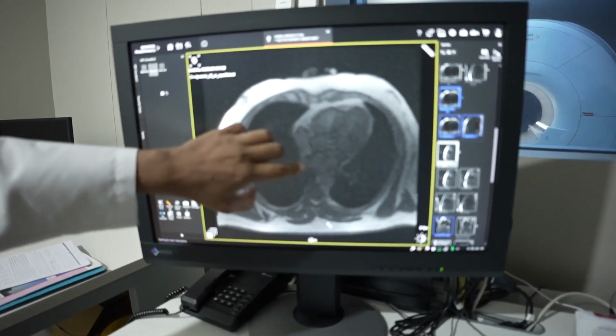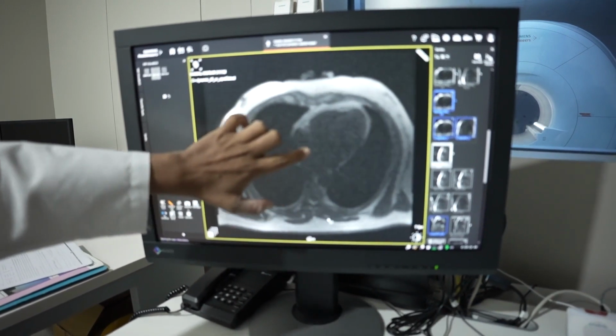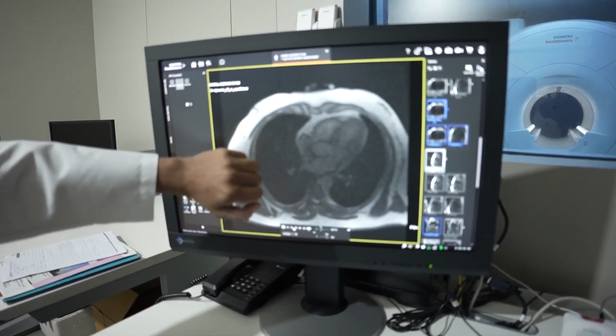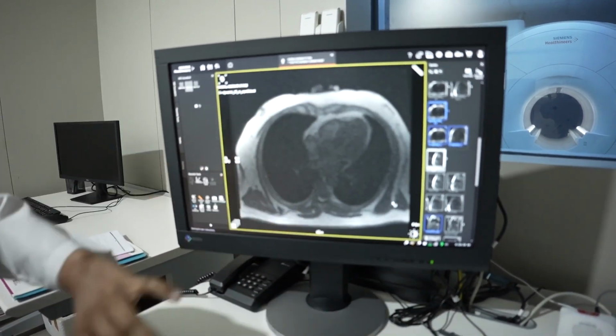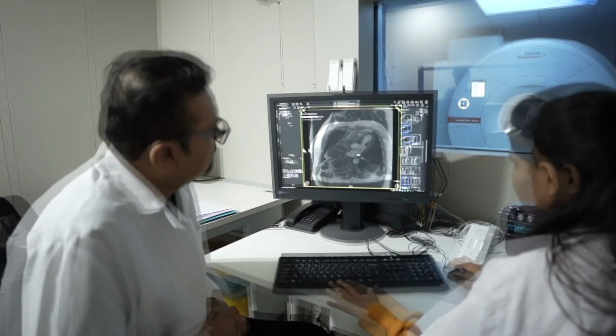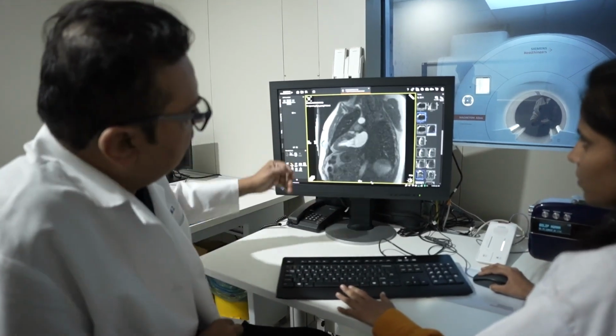You can see the blood flow is coming, and that's the actual blood flowing. And you can see how the muscles are kind of lighting up like it's supposed to. Now just a different view, but you'll get to see how the blood flows into it.